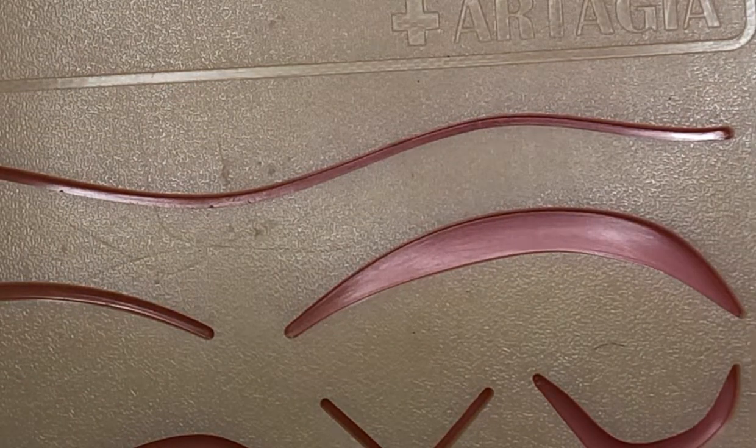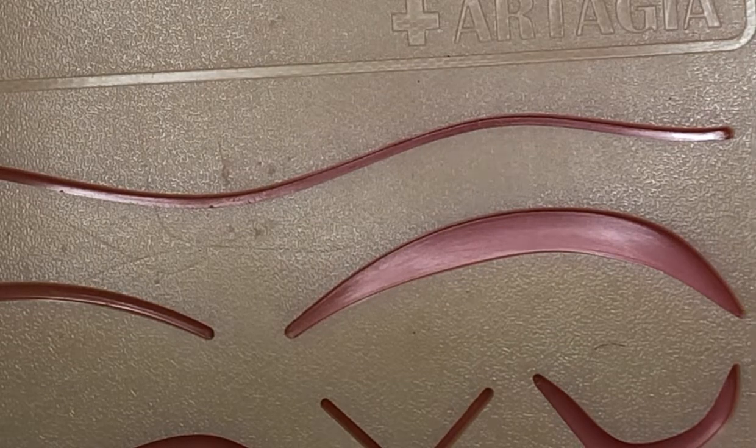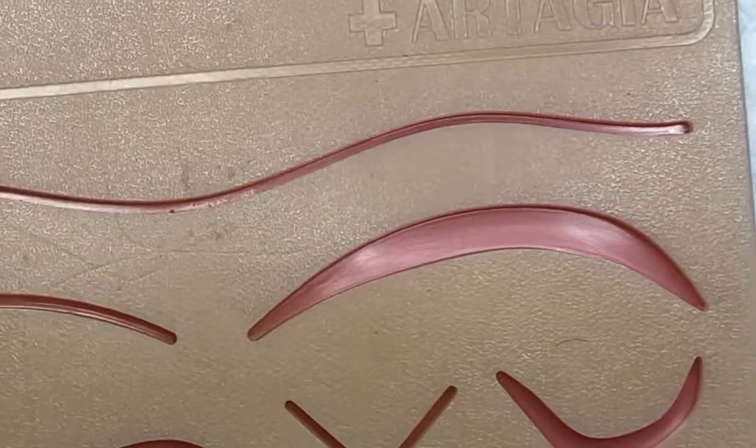This is another great suture to have at your disposal when you've got a wound that may be under significant tension and you're really trying to reduce that tension in the wound.